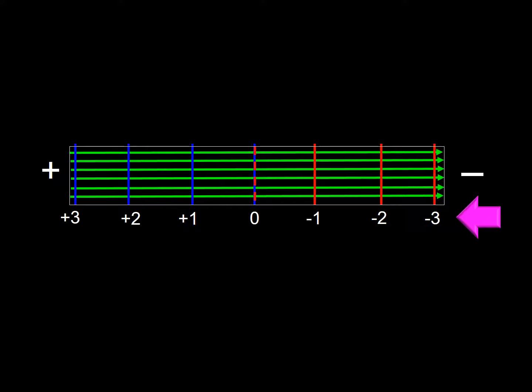The relation between maximal negativity and maximal positivity can be expressed numerically as indicated by the arrow, with 0 being the point at which polarity shifts from positive to negative in the dipole. I have represented 0 by the blue and red dashed line in this drawing. On the other side, the blue lines represent positivity and the red lines negativity. Also notice the white rectangle. I have placed it there to indicate that the electrical current adapts to the structure through which electricity is being conducted.